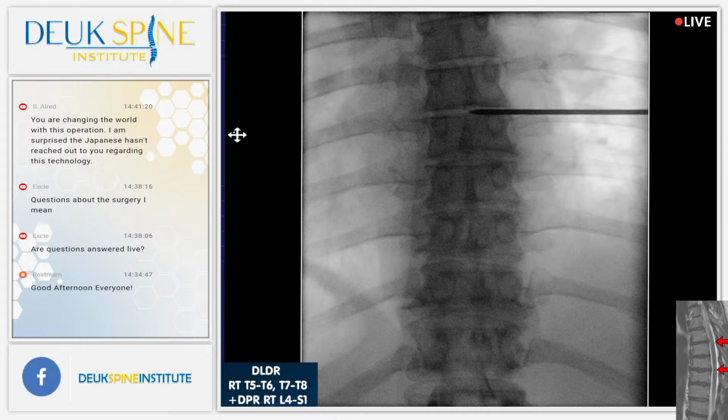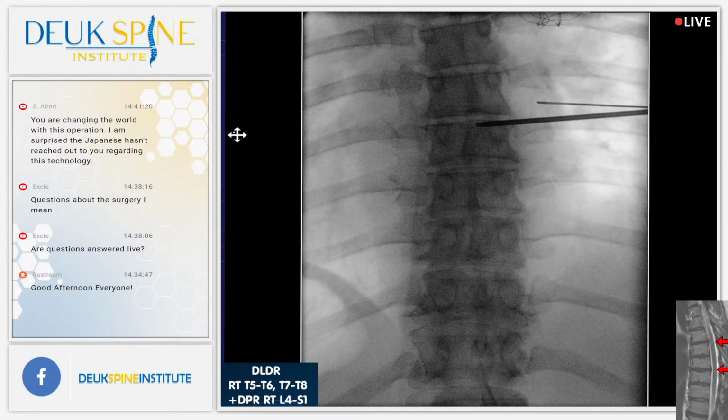So do we numb them? Let's give a little more numbing medicine. You're going to feel a little stick and burn. Sorry about that. A little more going in. That's just to help make you more comfortable. Burns a little bit. Shot. Okay.